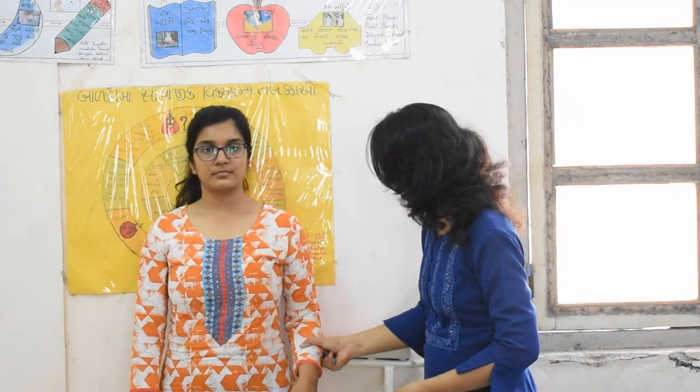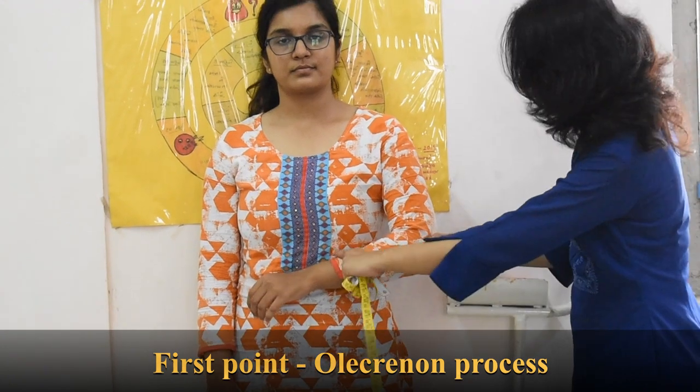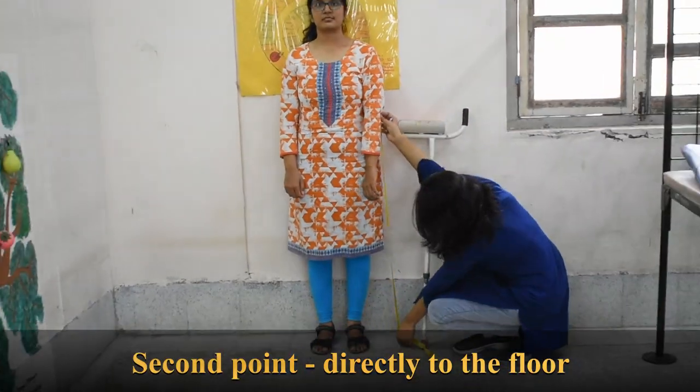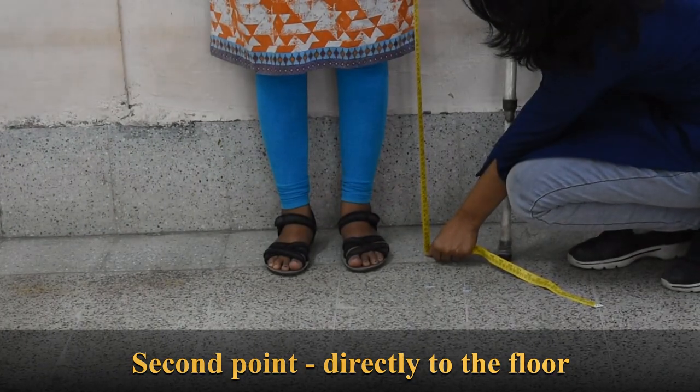To take the measurement for the gutter crutch in standing position: we take the point of the elbow, that is the olecranon process, as the first point. The second point is directly down to the floor. From the point of the elbow to the floor — here it is 14 and a half inches. That is the measurement for the gutter crutch in standing.